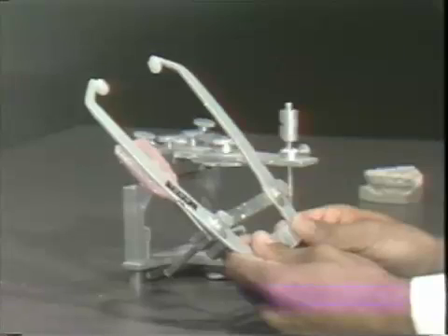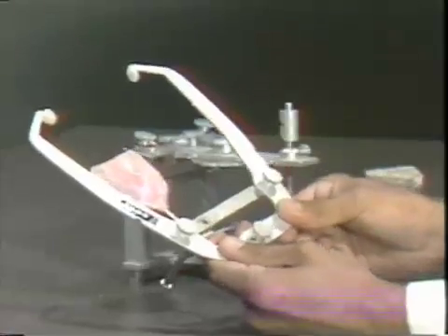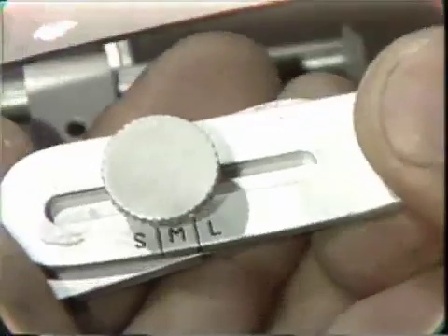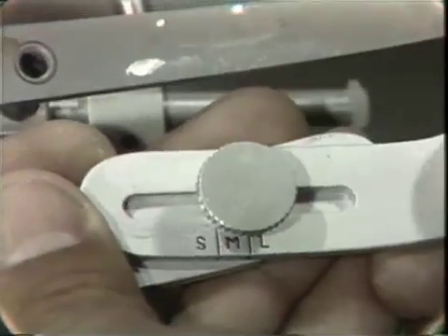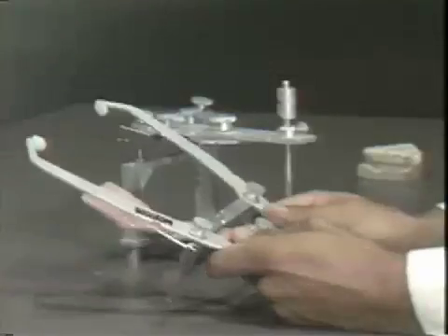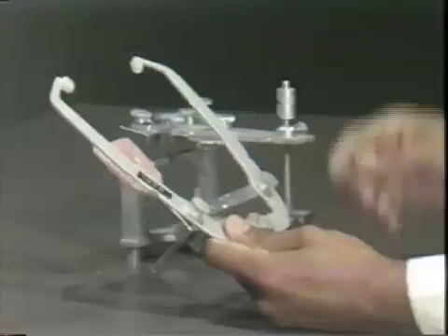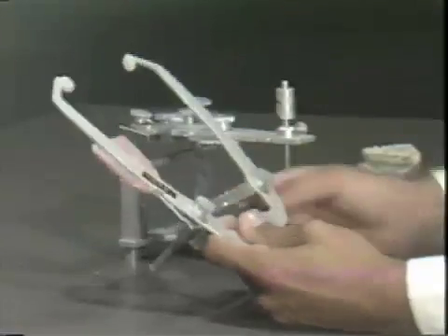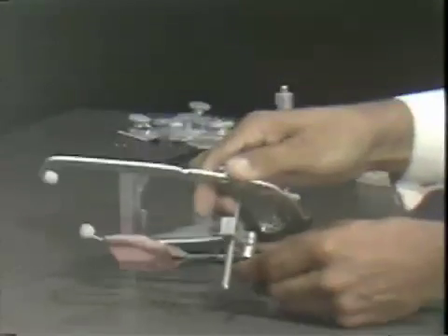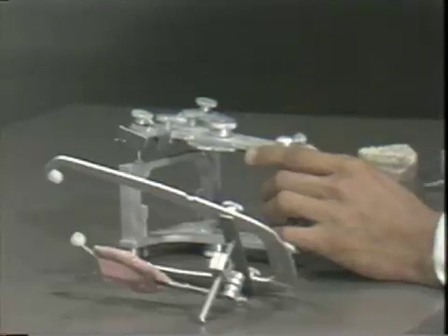These nylon tips go into the auditory openings, and in the front there is a scale. If you end up on the S, you know the patient has a small intercondylar distance; there is also medium and large. This is a self-centering facebow so you don't have to worry about adding millimeters and dividing by two. In this particular case, we will not be taking the facebow off the patient, but will go to the articulator with the facebow setting determined by these two adjustments. To use the facebow, one has to take the incisal guide pin out and put that aside.